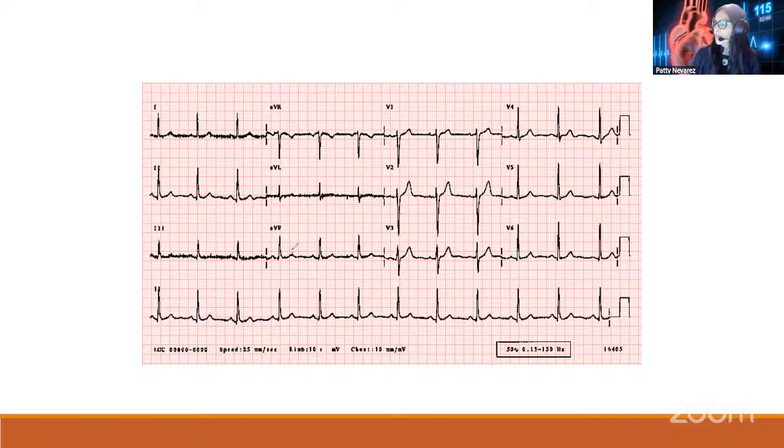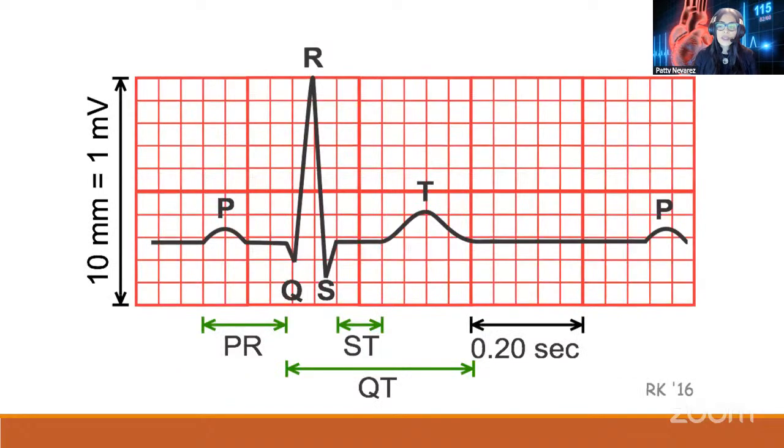There you go. Now, when we look at an EKG, what are we looking at? It looks like a lot of something when we don't know what it means. So for that, I have this image so we can describe a little bit of what's happening. We already know about the action potential, from the beginning of the course, so you can understand how the current is transferring in the myocardial cells. Again, we're more likely going to work with lead 2.